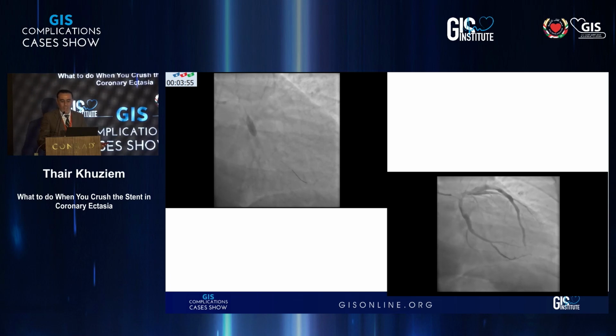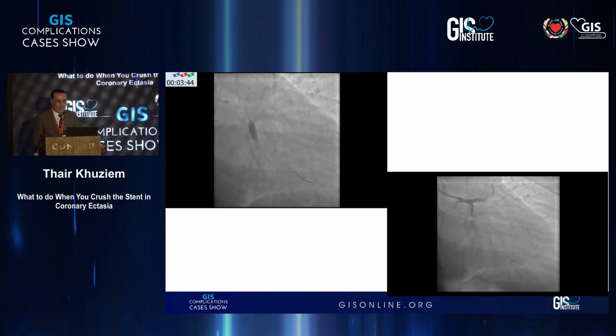And we inflated, and after we inflated the balloon, we noticed that we crushed the proximal part of the stent, and the result became ugly. It's even much worse than before we intervened.